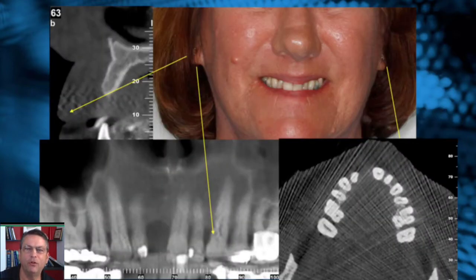Even though the earring is way back on the face, you can see the waves across all of the teeth. It makes the teeth look irregular, and there might be a feeling like there's something going on in the teeth, but it's not. It's the noise introduced into the scan.